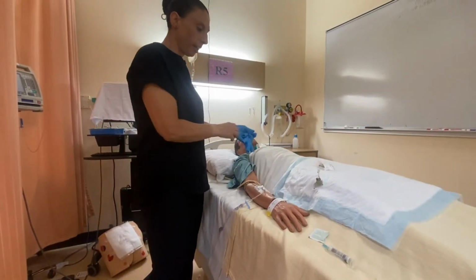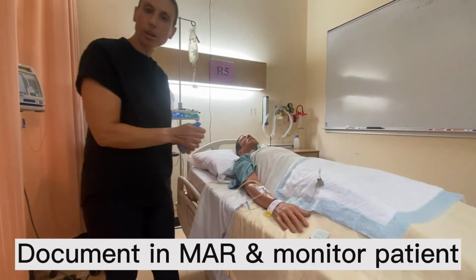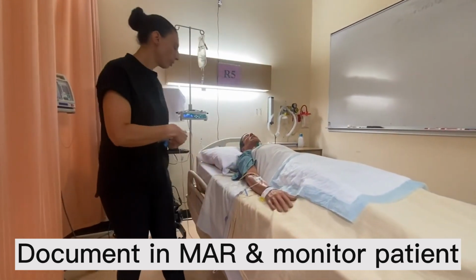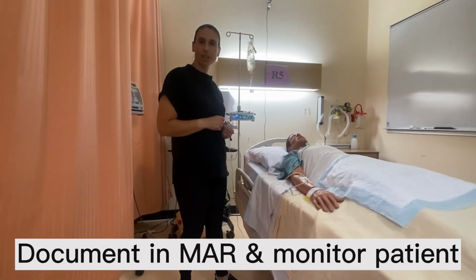And then we can just throw out our supplies, and once we leave the room, we would want to document in our MAR that we have given morphine 5 milligrams. And of course, we would monitor our patient. How are you feeling? How's your pain level? And just continue to follow up.